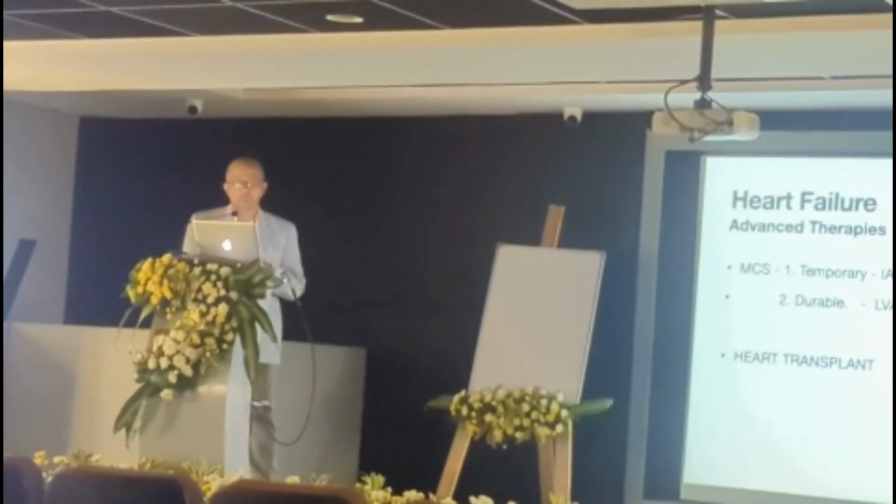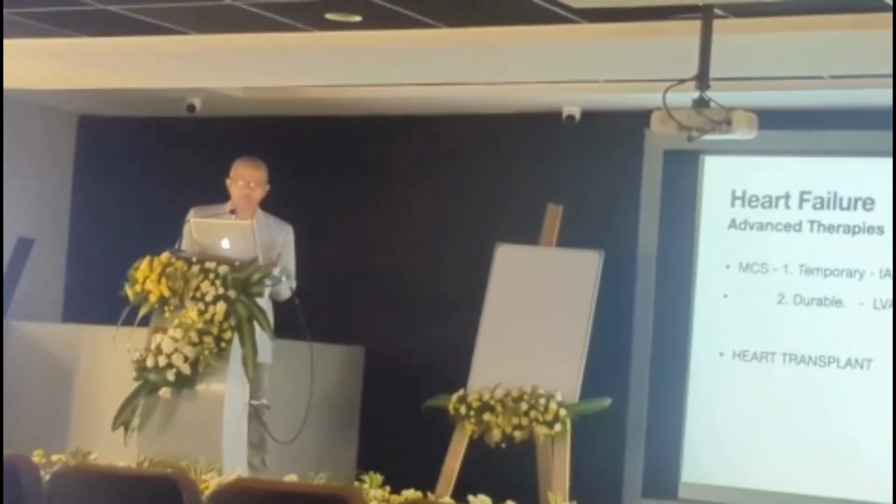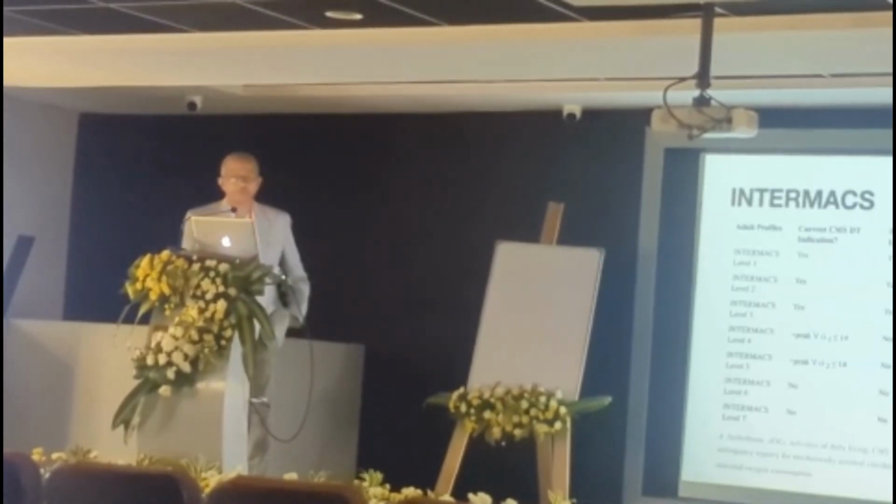ECMO depending on the requirement. Then we have the durable ones, which can be either LVAD or the RVAD. I will not be going much into detail on it. And then the heart transplant.